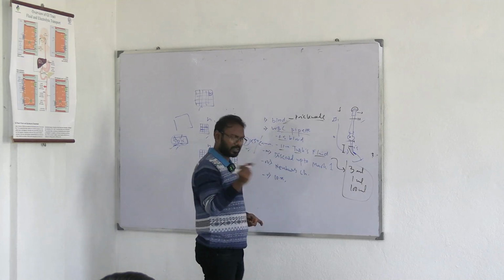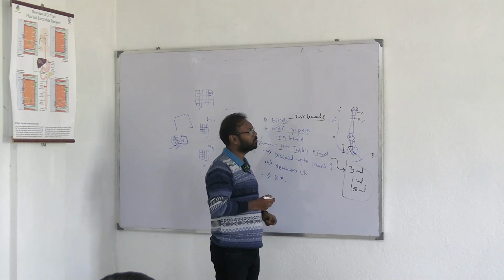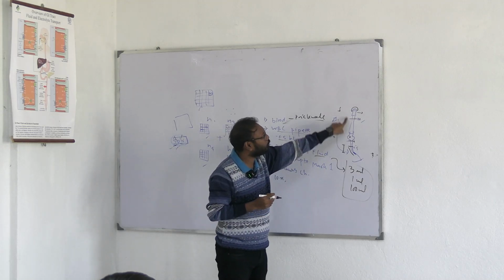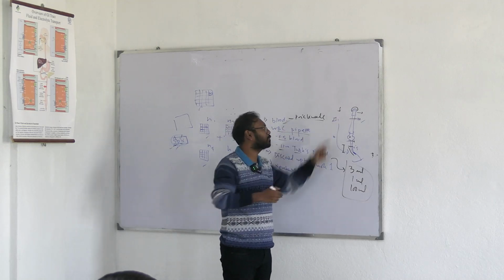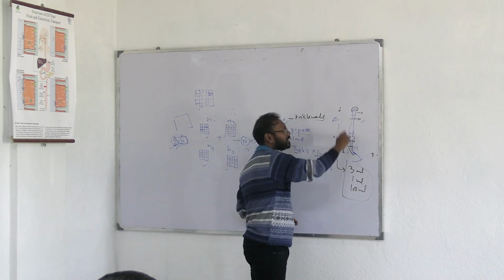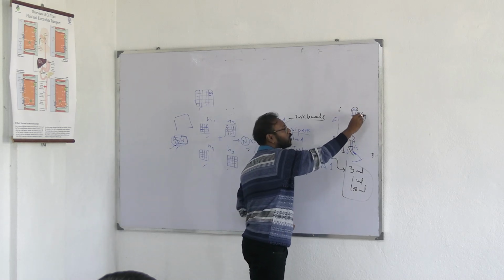Now on the previous day, a lot of people actually took this fluid over 11, then they discarded it down to 11. So what happened? The mixture changed and the fluid was a lot more.